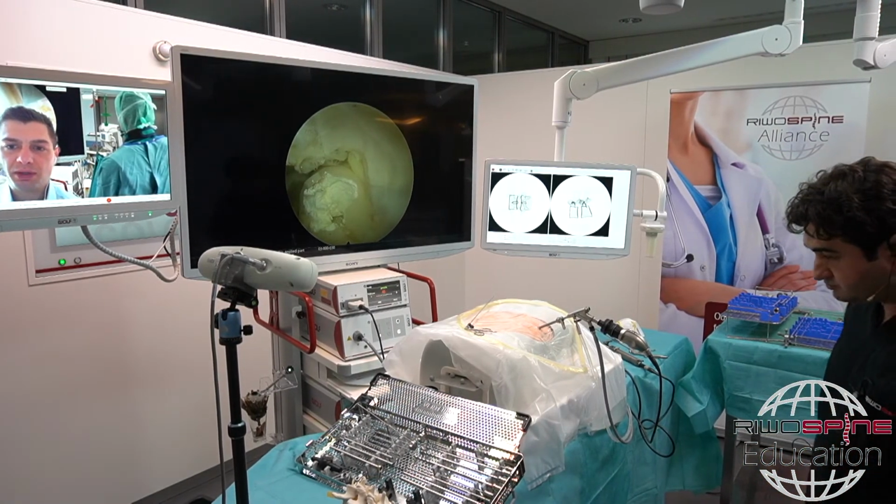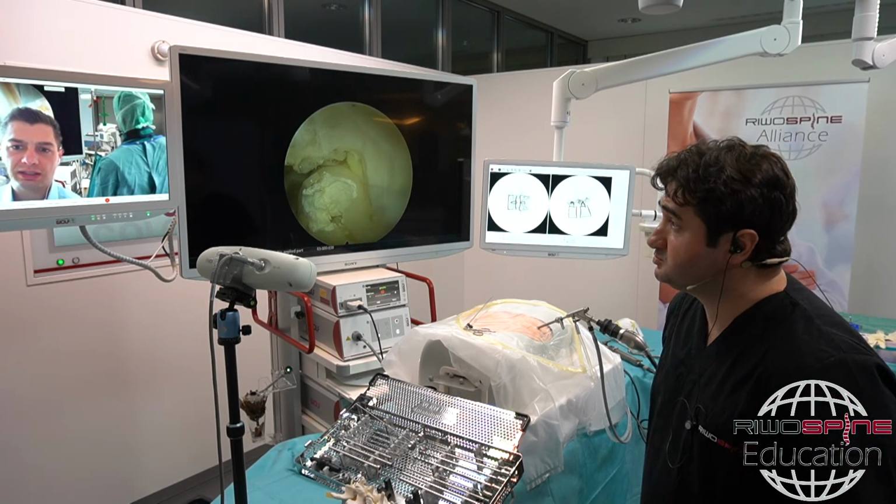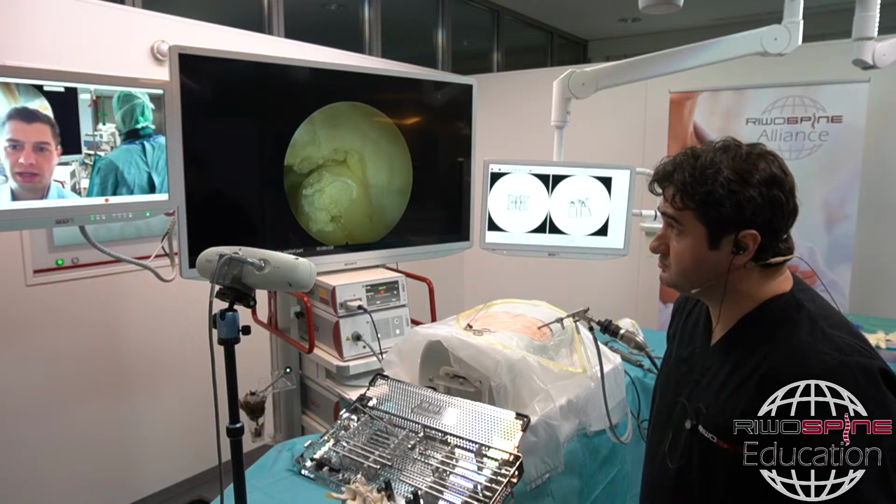Should I use the foraminoplasty set to do this under radiologic control, or should I do this under visual control as you did right now?